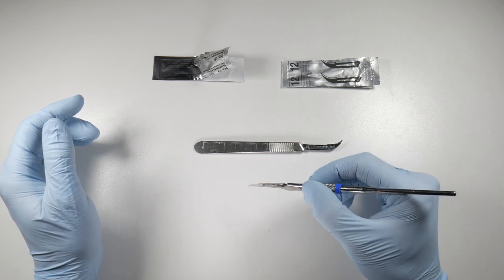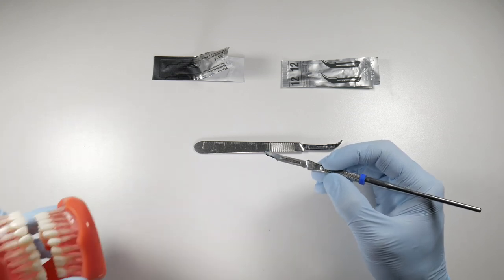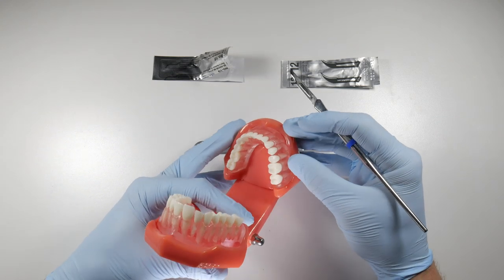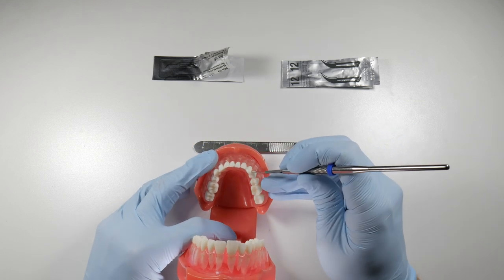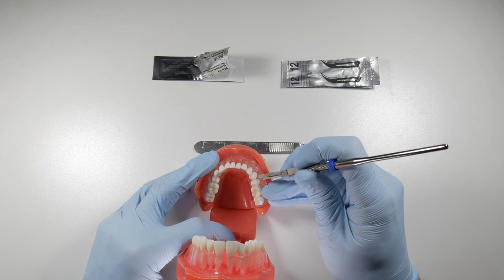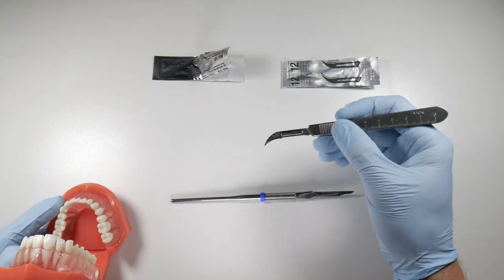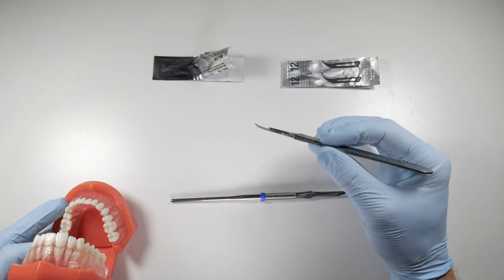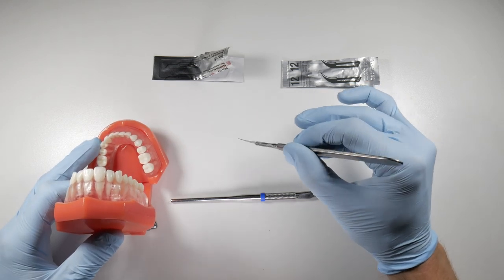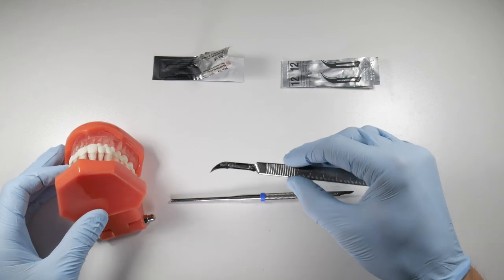The reason I like this is because if we're going to be incising, most times when we're releasing a flap, we're cutting around teeth. We're trying to trace the gingiva of a tooth. Doing that with this is way easier than using this clunky kind of popsicle stick shaped scalpel. Trying to roll this and kind of carve around the teeth, it's just not as natural or as easy as that rounded handle.